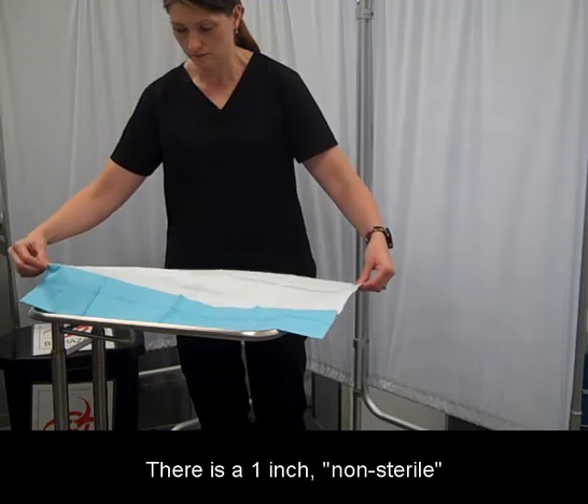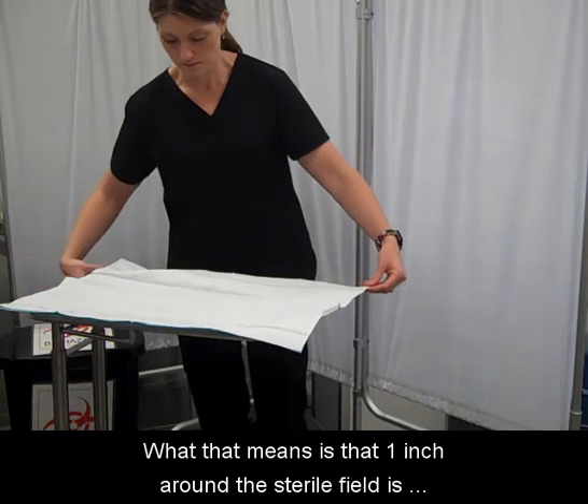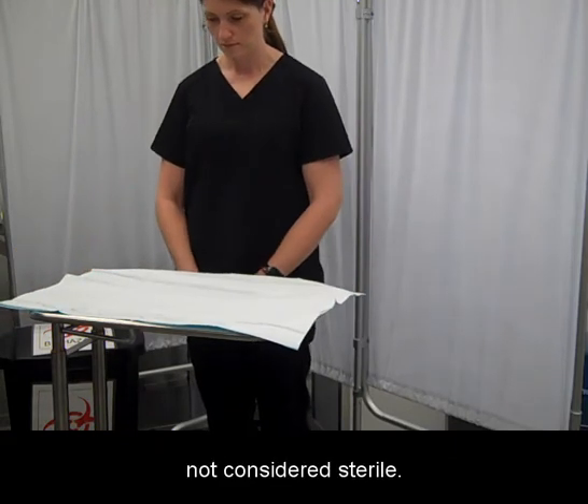There is a 1-inch non-sterile border around the sterile field. What that means is that 1 inch around the sterile field is not considered sterile.